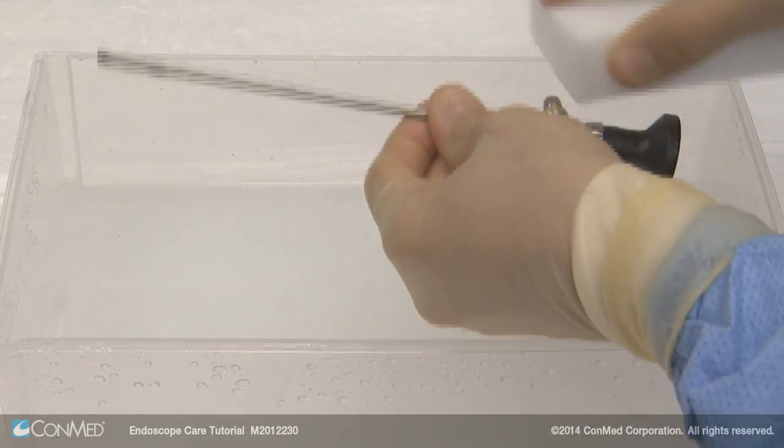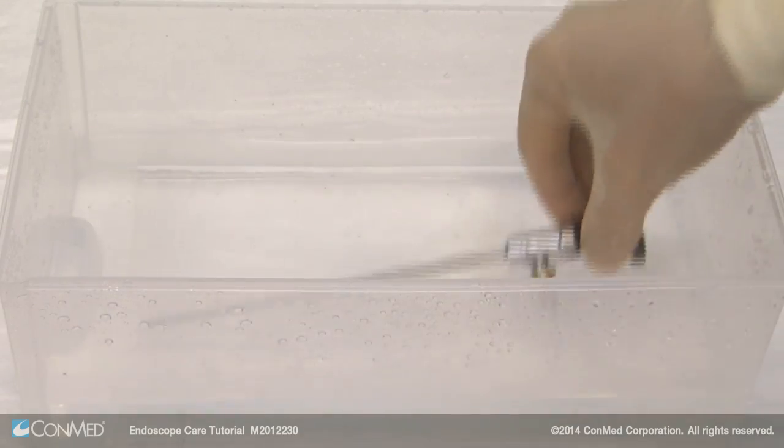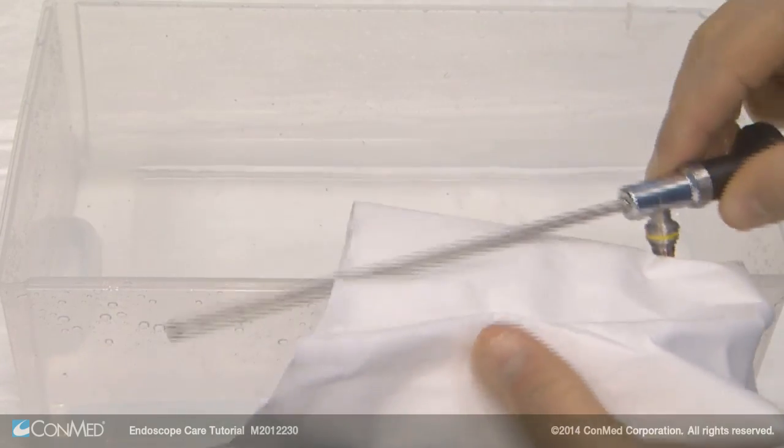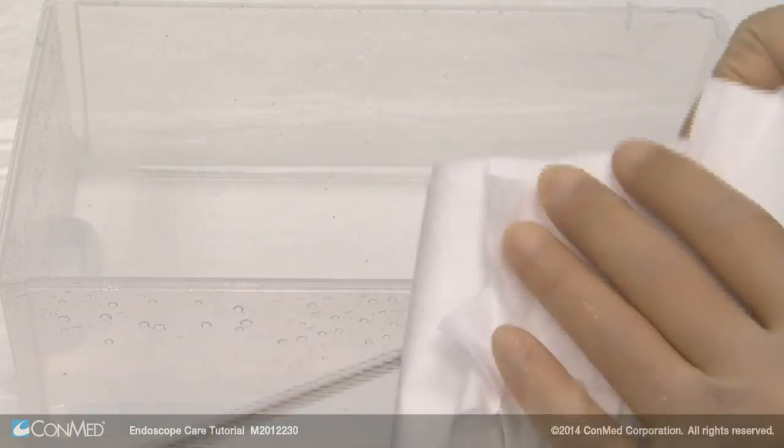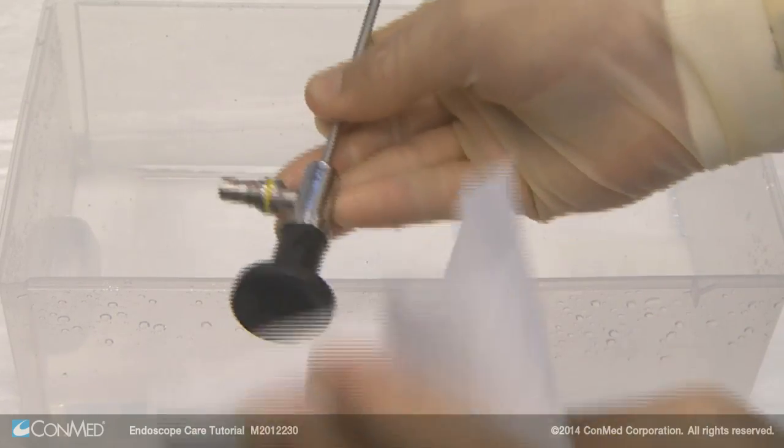Do not place endoscopes in an ultrasonic cleaner or washer sterilizer. To rinse, use clean, clear, non-saline water to remove all cleansing residue. Then carefully dry the endoscope with a soft cloth to ensure clean lenses.